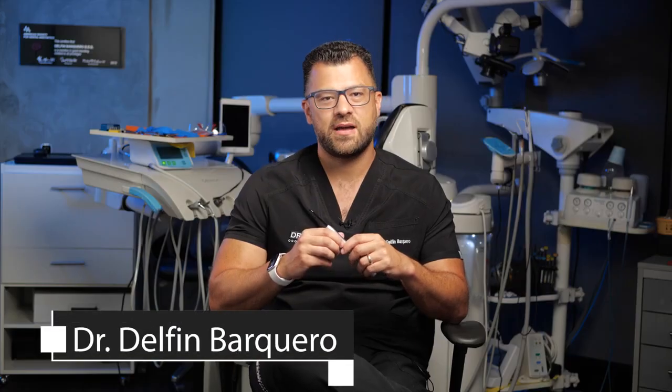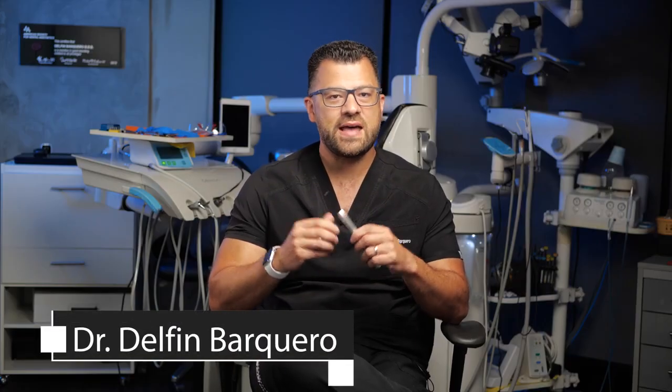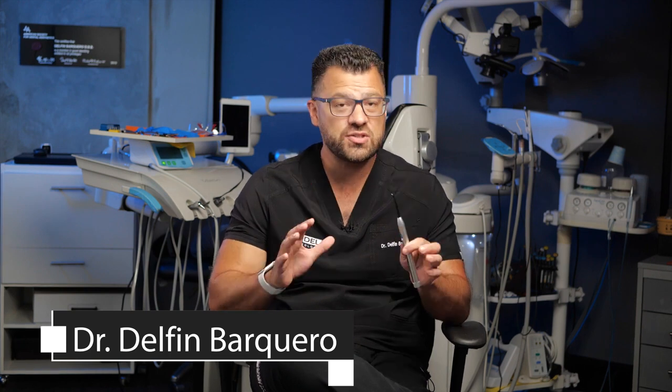Hello, my name is Delphine Barquer. I am a prosthodontist. As you know, modern dentistry struggles to keep as much as possible natural tooth structure. For me, it's very important to detect fractures on the teeth that I'm going to treat, or even cavities.